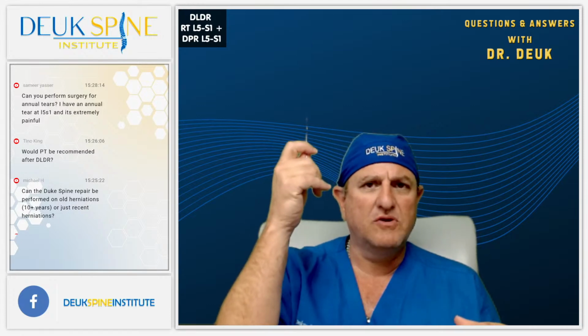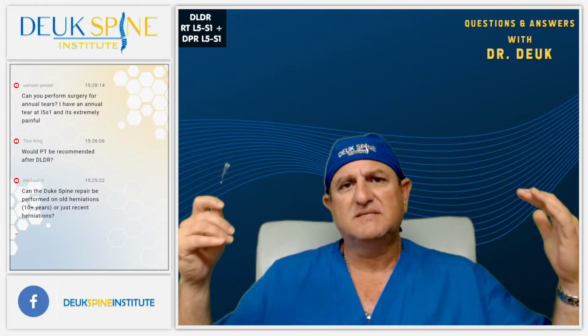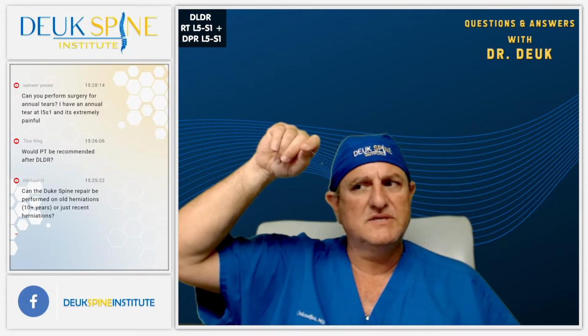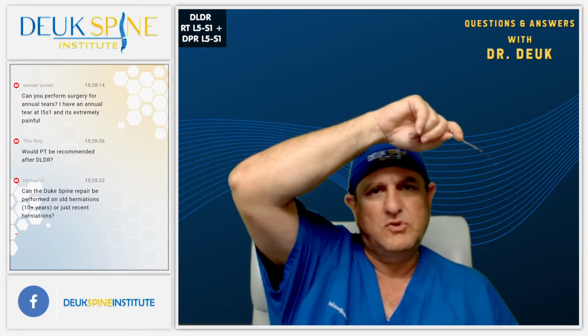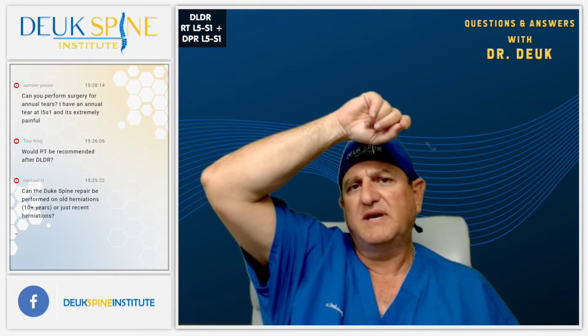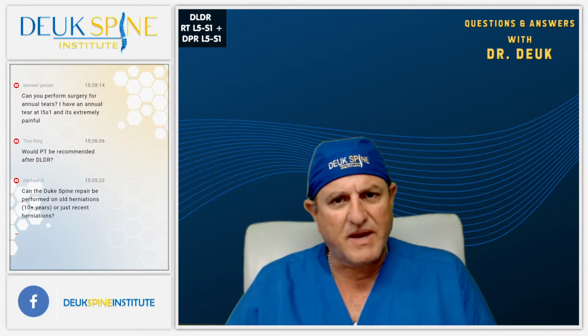It doesn't matter if your herniation is 1 day old or if it's 100 years old. It's the same problem. It's a tear in the back of the disc, whether the disc is freshly herniated and it's a nice annular tear that's inflamed, or whether the disc is 99% gone, there's a little tear in the back. I got to go zap that little guy with the laser. That's what takes the pain away.